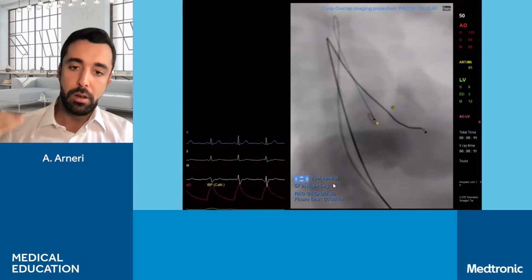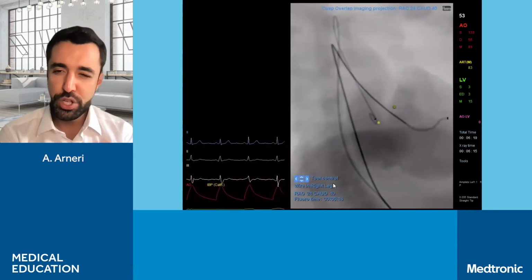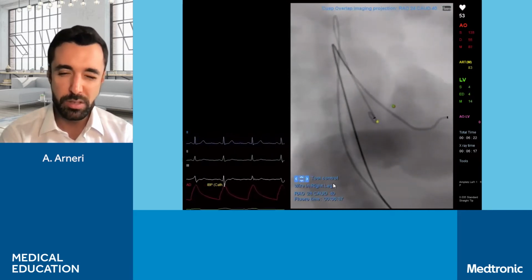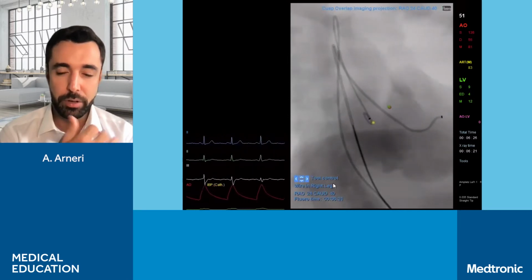And we're pulling back the straight tip wire. We're not pushing much the straight tip wire into the ventricle because it's straight. The ventricle can be really hypertrophic and there's a risk of perforating that.